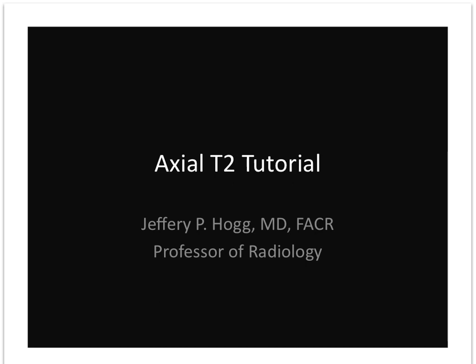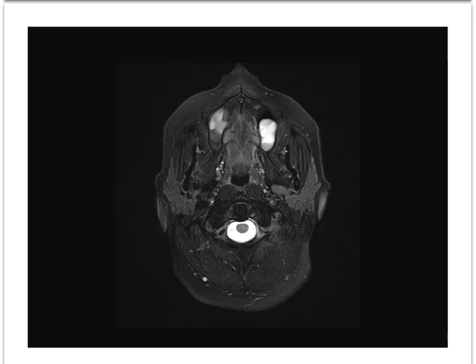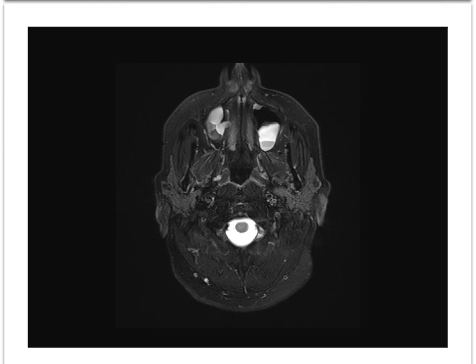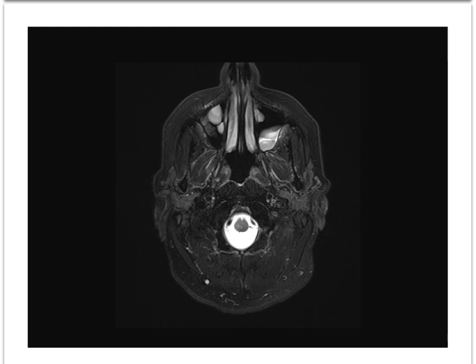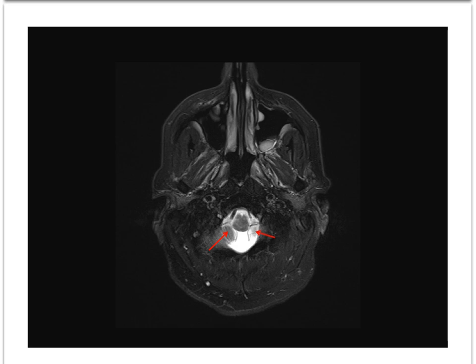This is an anatomy tutorial on axial T2 MR images. At this level, we see the slightly flattened ovoid contour of the upper cervical spinal cord. We see the vertebral arteries about to pierce the dura to enter the subarachnoid space at the foramen magnum. CSF in the subarachnoid space surrounds the upper cervical spinal cord, which remains slightly ovoid at this location. The anterior median sulcus between the pyramids is visible at this level.